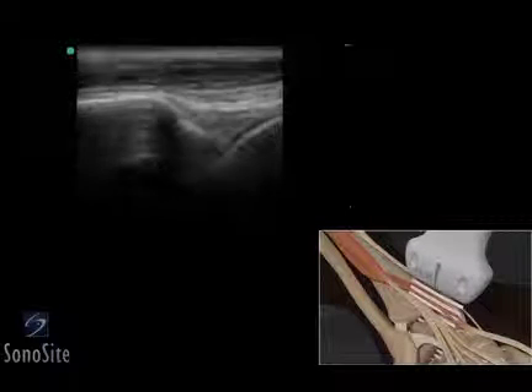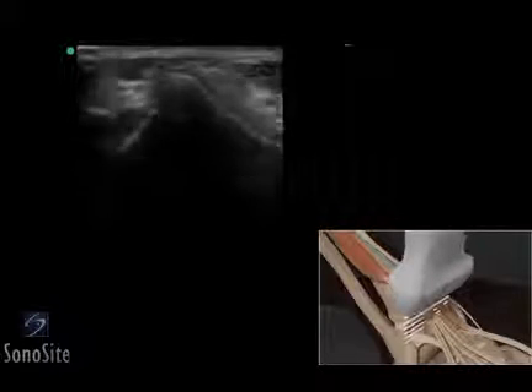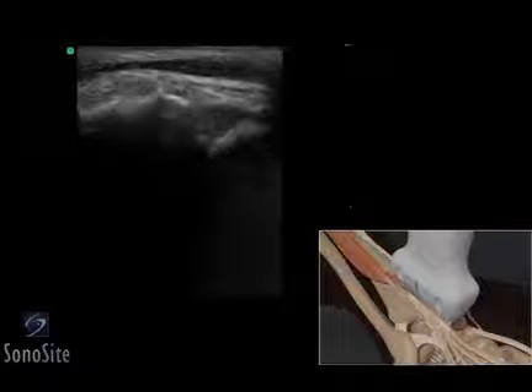The transducer is then returned to a transverse orientation to scan the extensor digitorum longus tendon in a similar fashion to complete the examination.